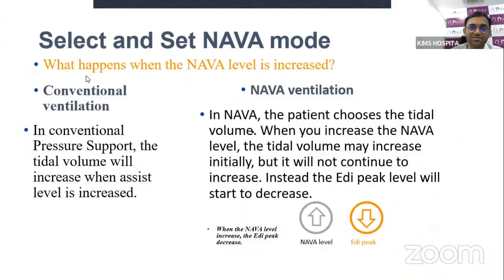What happens if the NAVA level is increased too much? In conventional ventilation, if you increase the pressure support, what will happen? The tidal volume will keep increasing, and there won't be any other corrective measures. However, in NAVA ventilation, the lucky thing is that when you increase the NAVA, which means we are increasing the respiratory support and taking more of the work of breathing, the tidal volume will increase transiently.